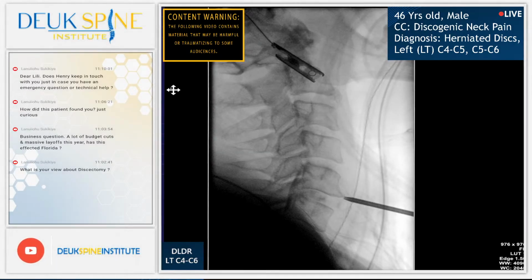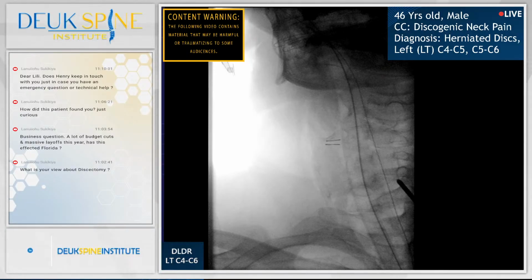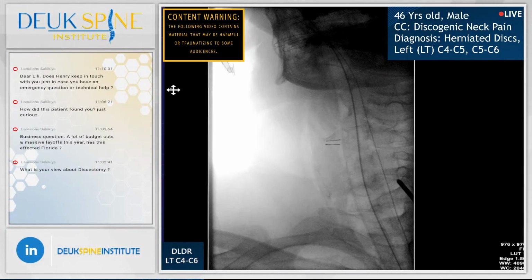Shot. I'm right on the edge. I can feel it. And this is an all-feel thing. You've got to have good hands to do this. I'm going to check my front back view to make sure, whoops, I slipped back in the disc. I'm going to check my front back view to make sure I don't come off the midline. I want to be in the middle of the spine. Hold on. Shot. Nope. Slipped again. Hold on. Hold on. I moved up a little bit.